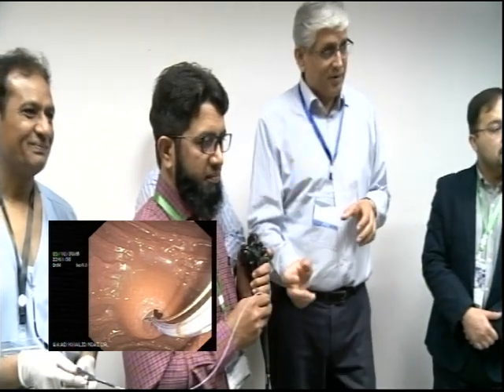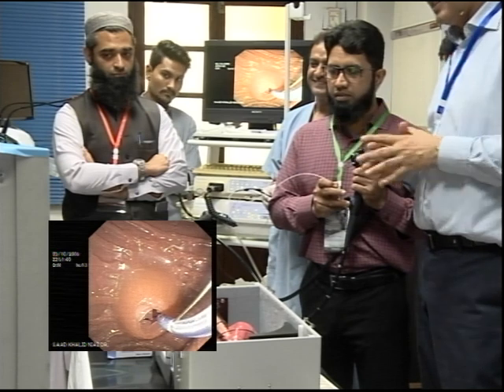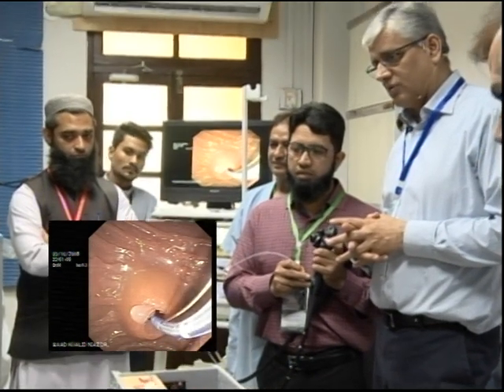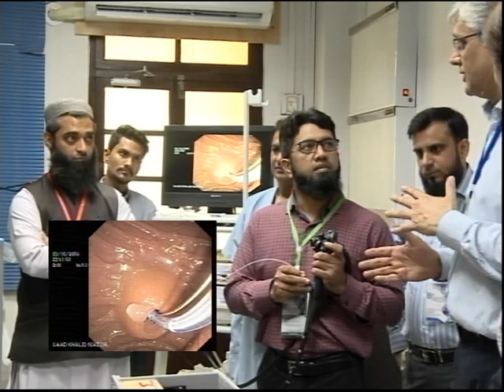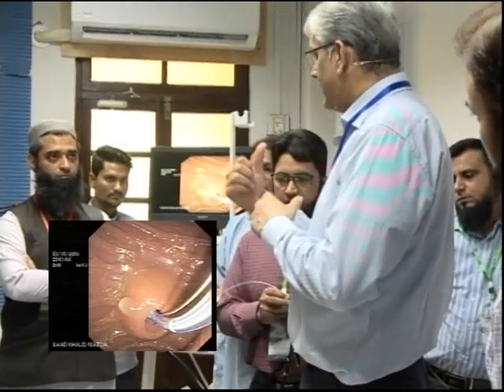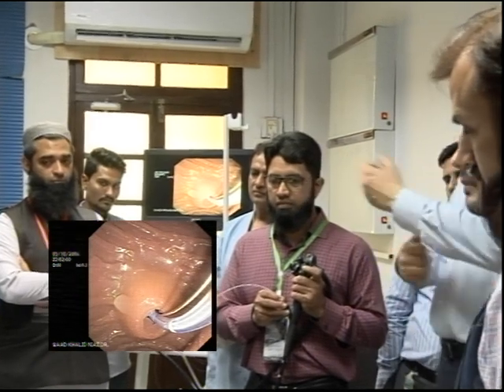Now, come back a little bit. Where do you want to go? This is very easy, this is open, but where would you want to go for CBD? At 11 o'clock. Okay, so how do you go to 11 o'clock? Now you've got the elevator, right? We haven't touched the elevator at all. That's the other thing that actually advances. When you elevate it, you're advancing upwards, and so the cannula will go in.